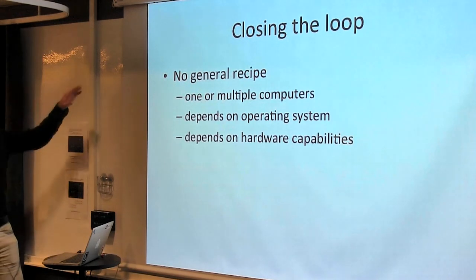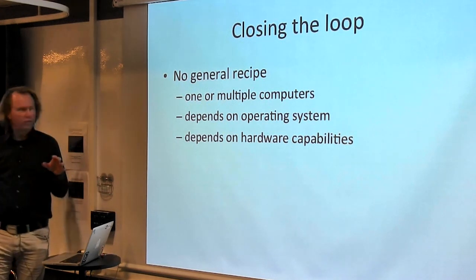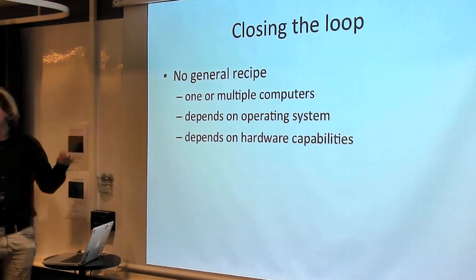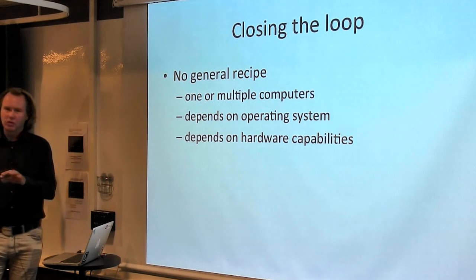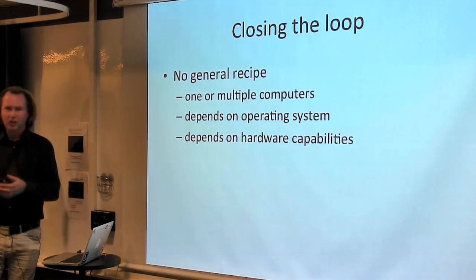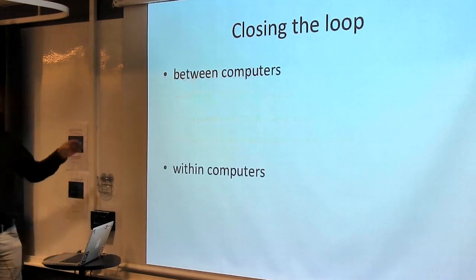For closing the loop, there's not really a general recipe. It really depends on whether you have one or multiple computers, on the operating system, and on hardware capabilities. Sometimes you have a device that you can connect to with a parallel port cable, sometimes a serial port cable, sometimes with network, sometimes you need a BNC connection or so.